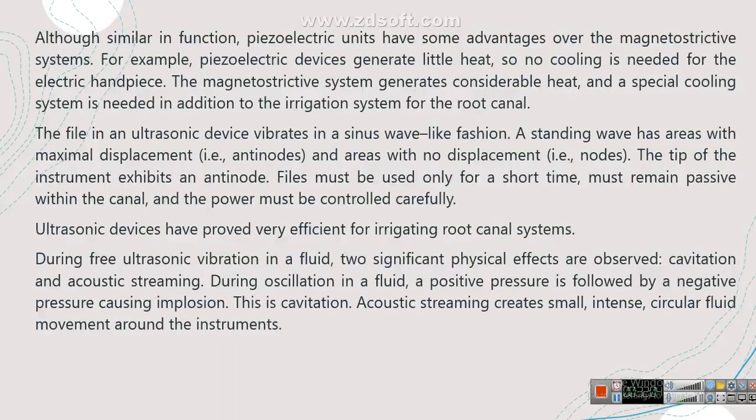The magnetostrictive system generates considerable heat, and a special cooling system is needed in addition to the irrigation system for the root canal. The file in an ultrasonic device vibrates in a sinus wave like fashion.